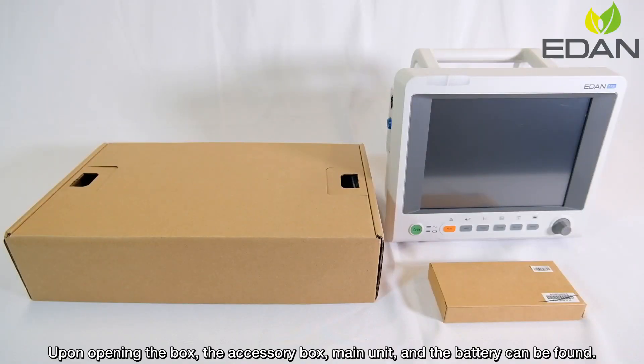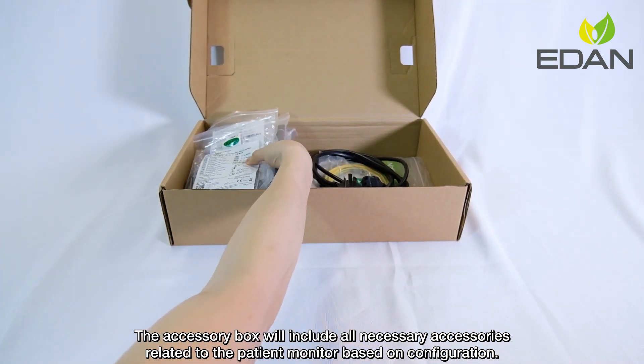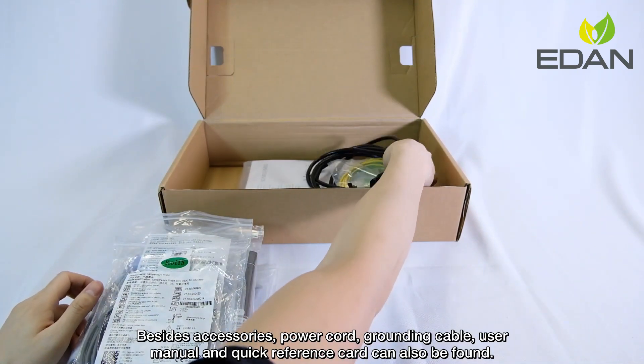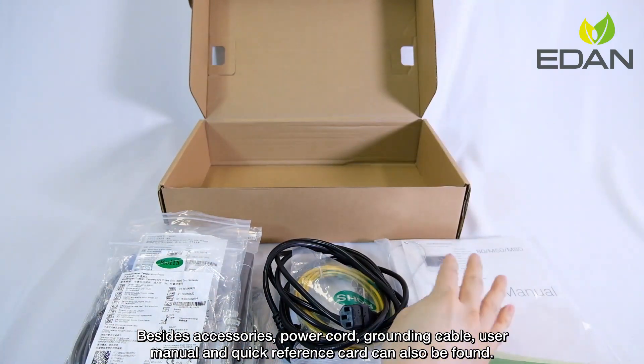Upon opening the box, the accessory box, main unit, and battery can be found. The accessory box will include all necessary accessories related to the patient monitor based on configuration. Besides accessories, a power cord, grounding cable, user manual, and quick reference card can also be found.